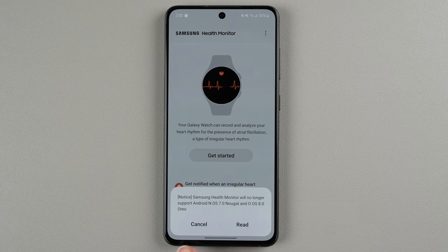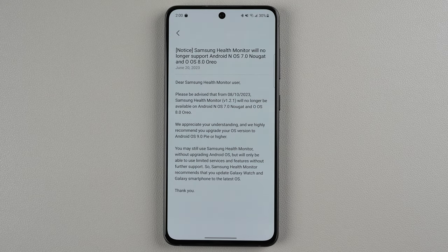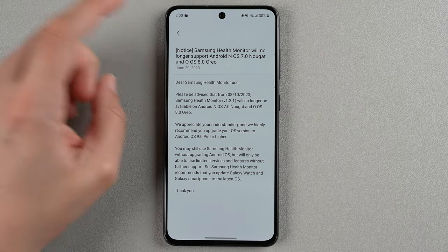It looks like you need to have a certain version of Android in order to use the Samsung Health Monitor app. You will need to upgrade your OS version in order to use it, otherwise you may have limited services or features.